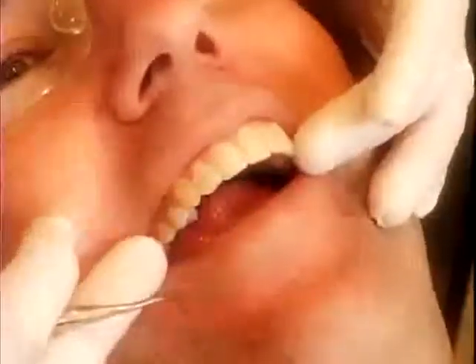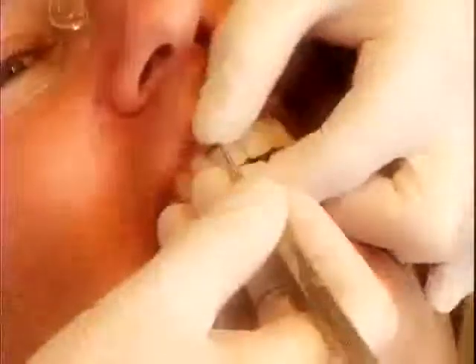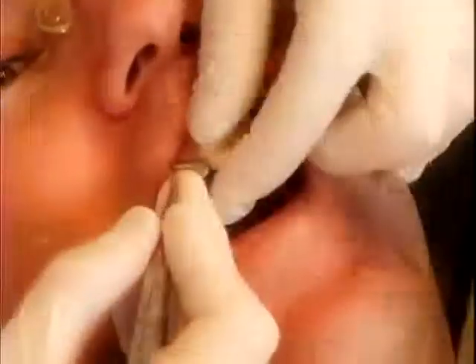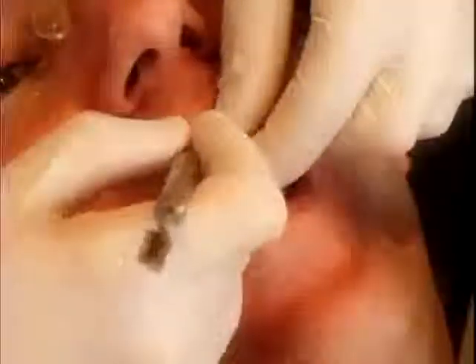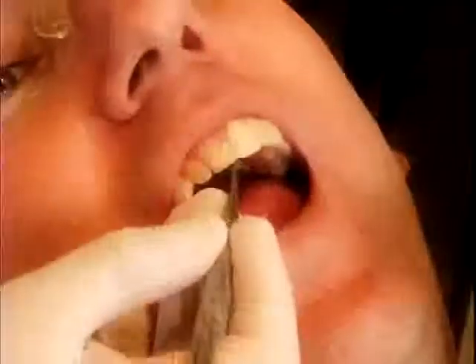We've taken off these 3 teeth at this point. We can already see that the shape has dramatically changed with some cosmetics. I'll continue removing the temporary. A great example is when we compare the 2 front teeth. There's some material still left on here, but note the color and the shape and the changes that occur from this tooth to this tooth. And we work our way together. Here we've taken care of your space issue.